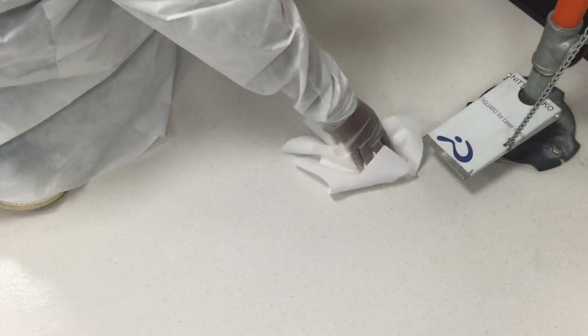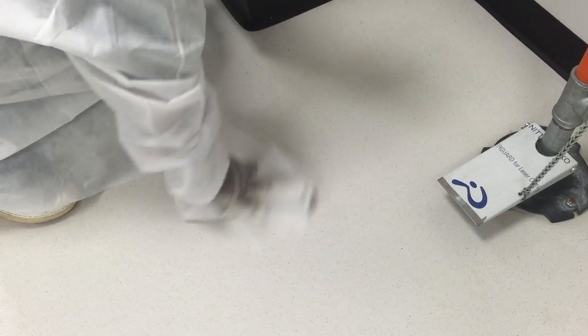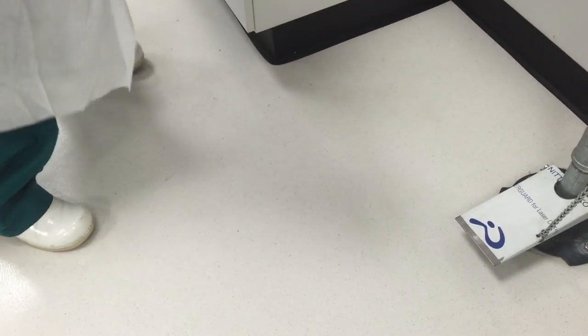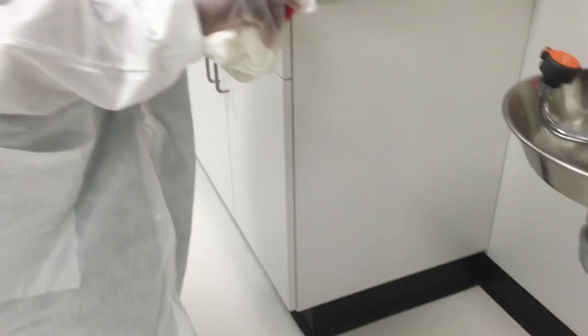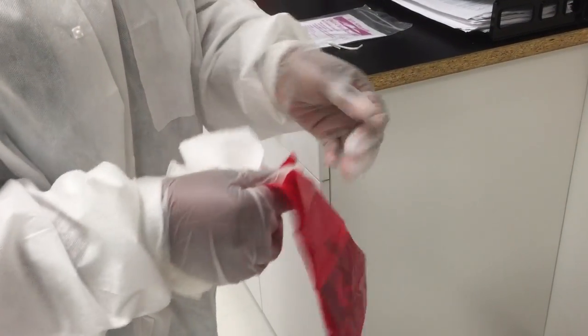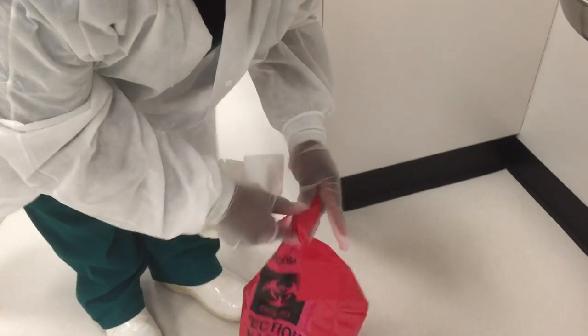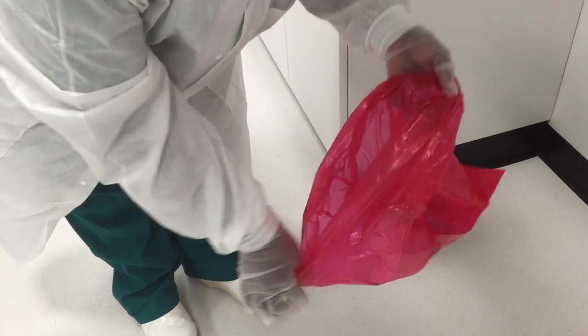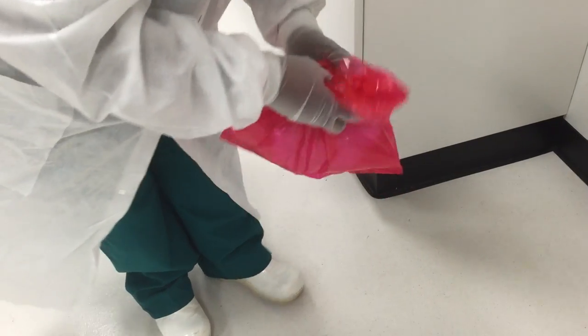We're going to wipe up our spill and make sure everything is clean. Depending on what was spilled, whether it be blood or chemicals, you're going to dispose of it properly. Our kit comes with a biohazard bag, so we're going to put that in there, and then dispose of that in its proper container. Seal it up.